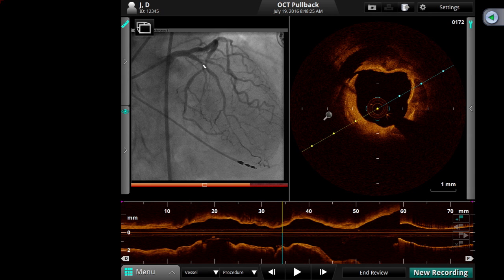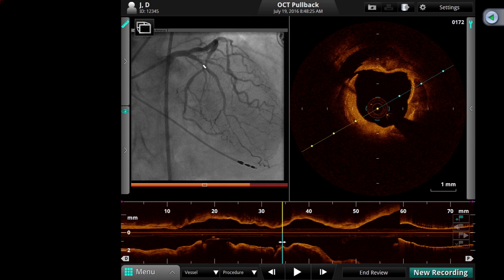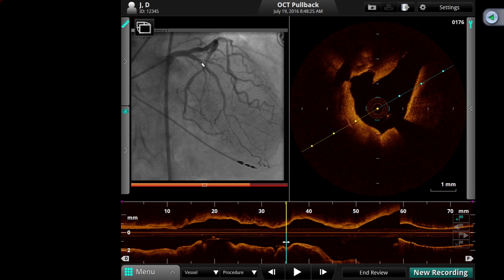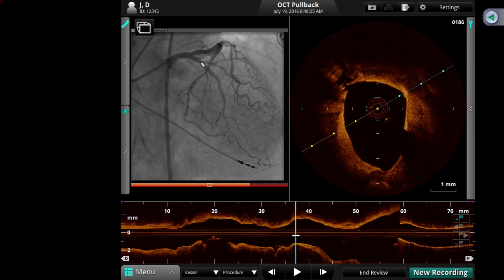So this is nice. See that? It's purely calcification. Chuck, from a calcification point of view, is it acceptable for OCT? Yep. For BVS it is. And there's a little dissection, which is perfect. It means you've done some good angioplasty. The lumen is nicely prepped, and just give us a diameter at the level of the septal now, and the diag. You see the two branches, nice.